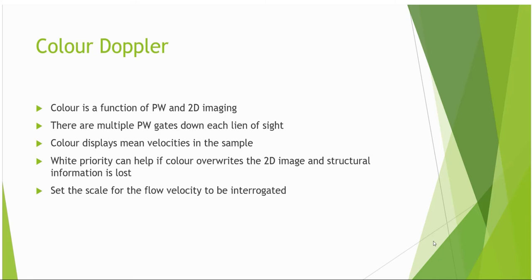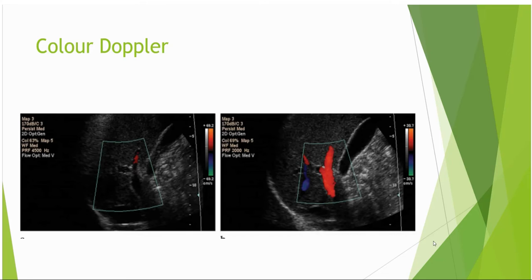Same for colour. A very high scale means that a very small section of the colour range close to the scale baseline in that direction is used to depict the flow. The detail may be hard to depict or lost altogether.